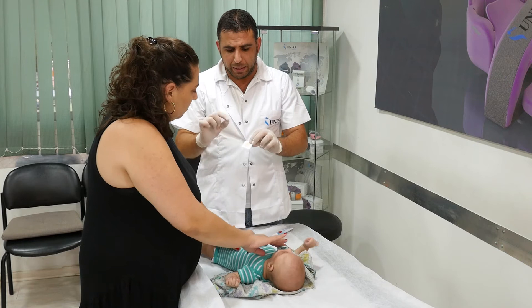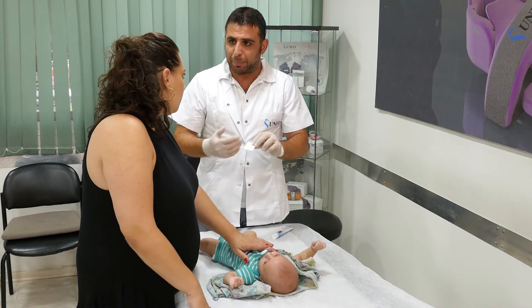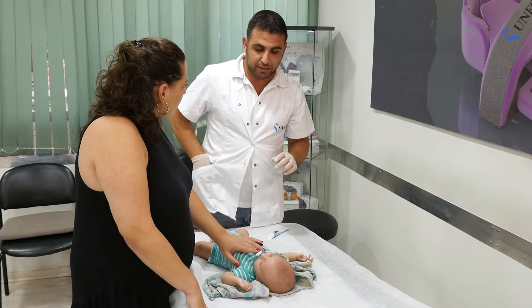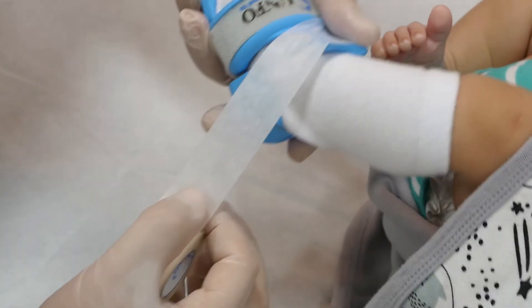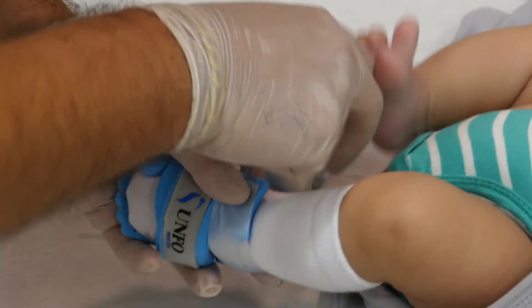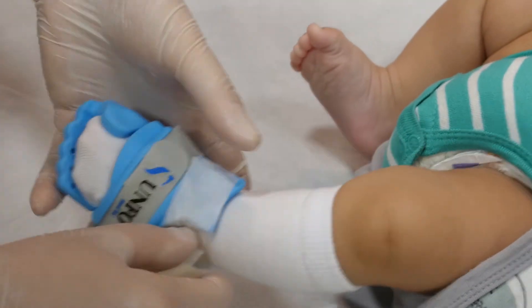If things get worse, consult your therapist. If the baby removes the brace from their foot, check if it was set up according to the instructions. If so, we recommend securing the brace three times from the heel to the cushion using a medical paper band-aid.